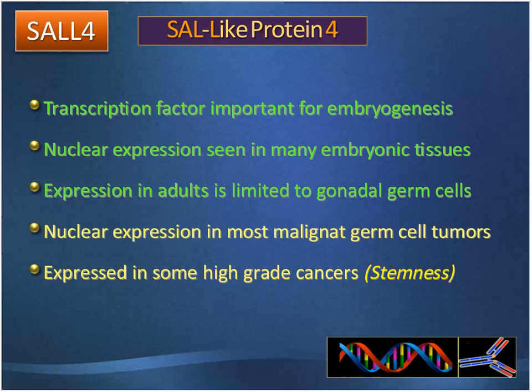Now, there are some high-grade carcinomas that may show positivity for SALL4 in occasional cells, and that is probably the embryonic stem cell type of reactivity. SALL4, as you know, is involved in embryogenesis, so it's not unusual to think that this marker could stain some embryonic stem cells in some high-grade tumors, not usually present in low-grade tumors.